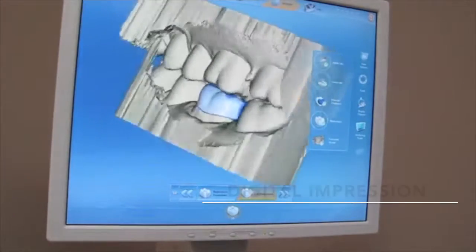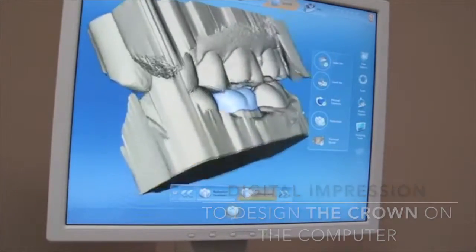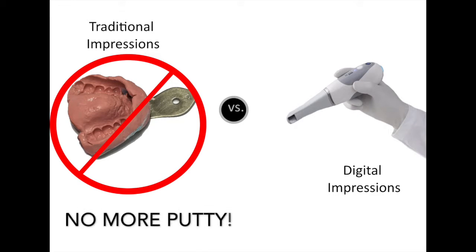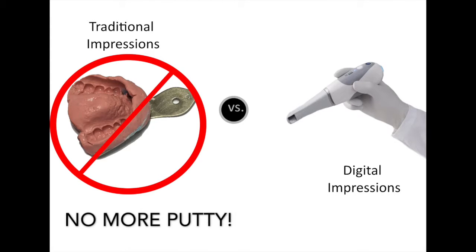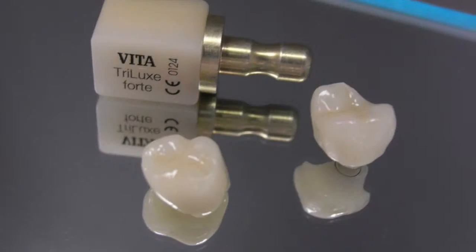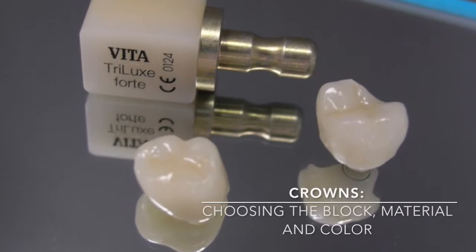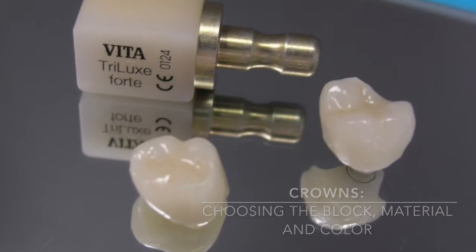Digital impression to design the crown on the computer. No more traditional impressions. Choosing the block material and color of the crown.